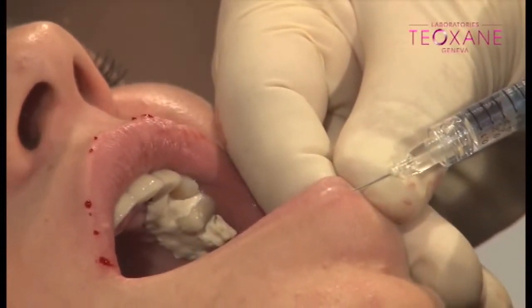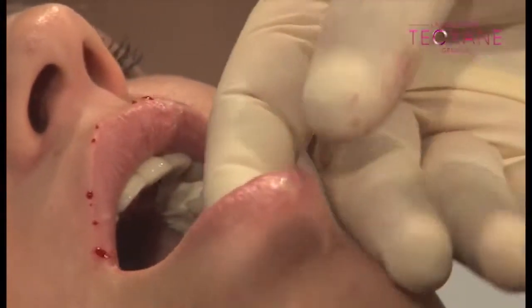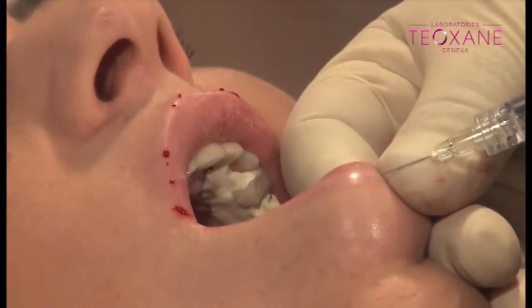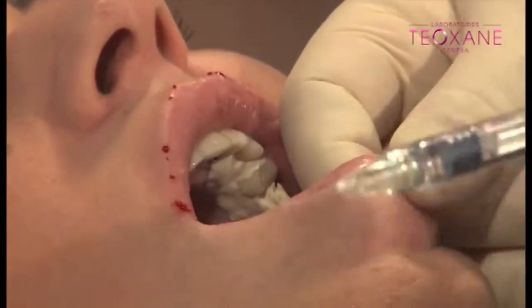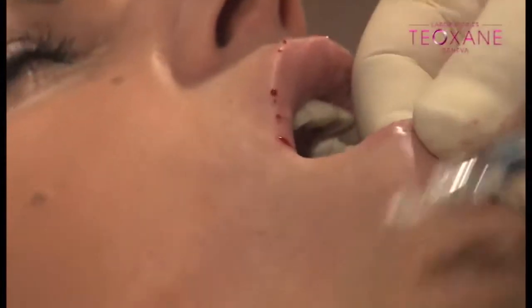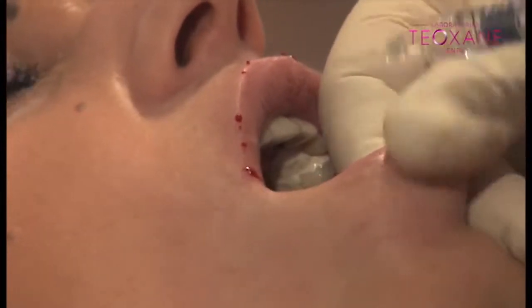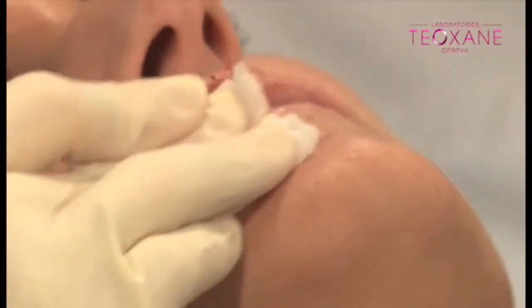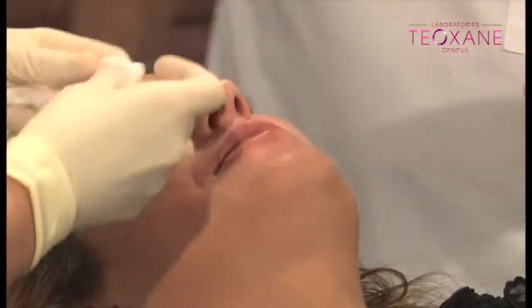You can see now exactly on the vermilion border — absolutely. See, it's running all along; you can see the whitening. You used about one syringe — yes, one ml of product.